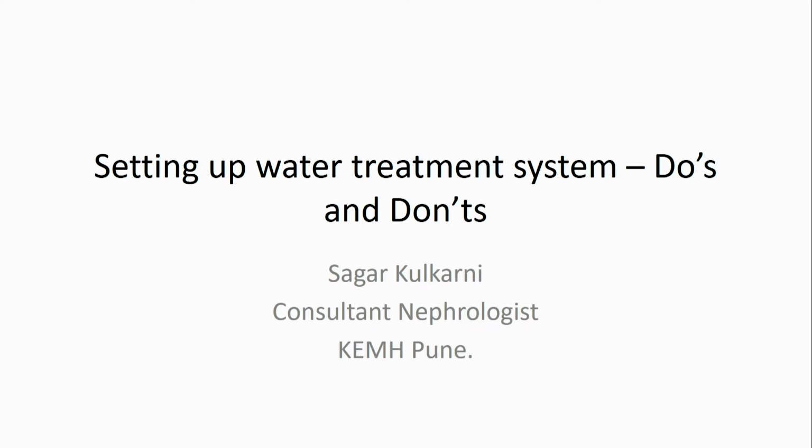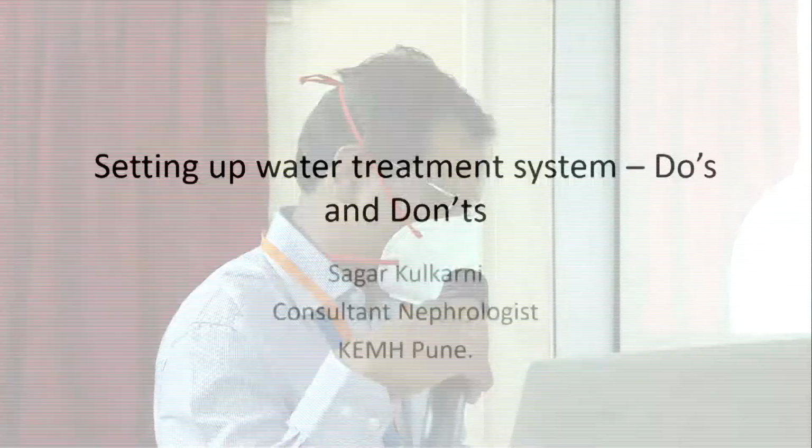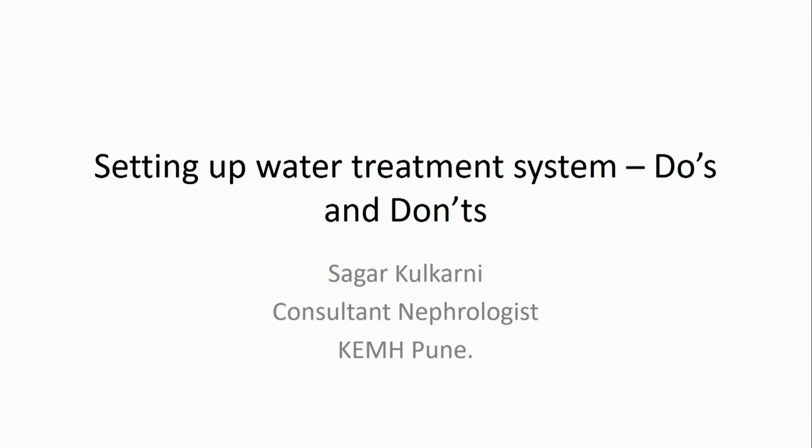So, the importance of dialysis water, the quality of that water cannot be overemphasized. One needs a good water treatment system to achieve good quality dialysis and thereby good patient results. Whenever a new center is set up, the water treatment is often left to the technician or the vendor, because the nephrologist doesn't pay much attention to that water treatment, and over maybe the next 3-4 months, the water quality comes down, and that is where the problems start.